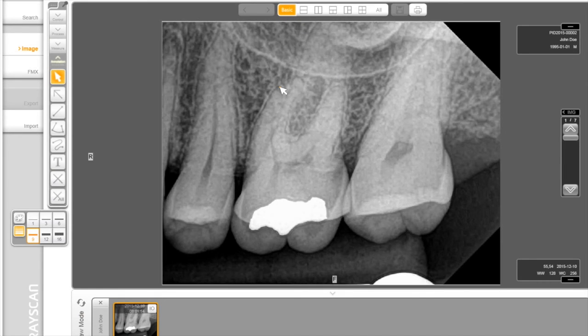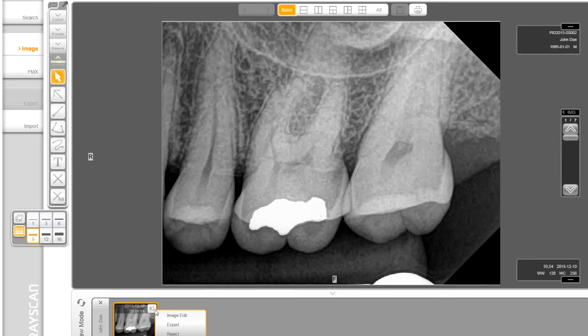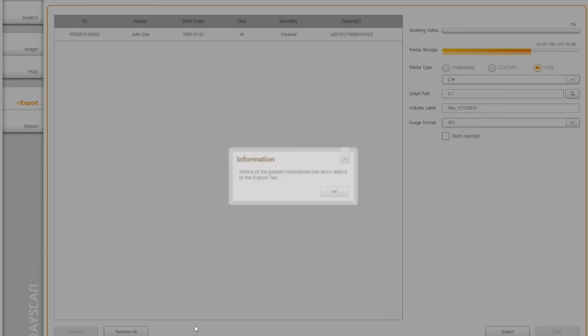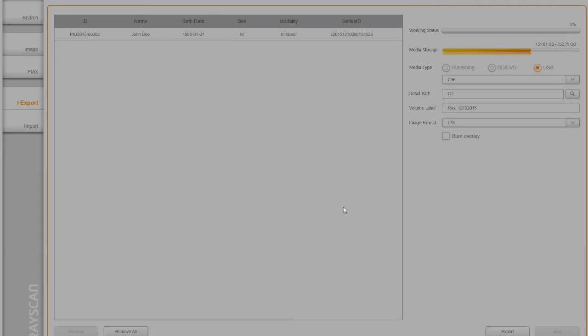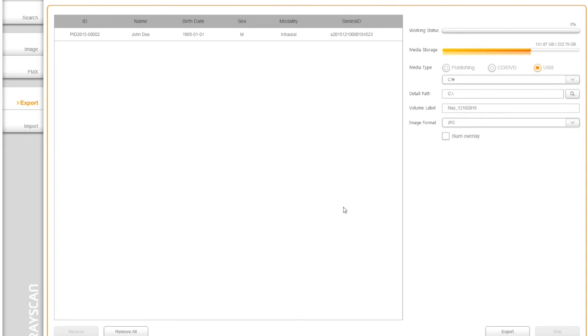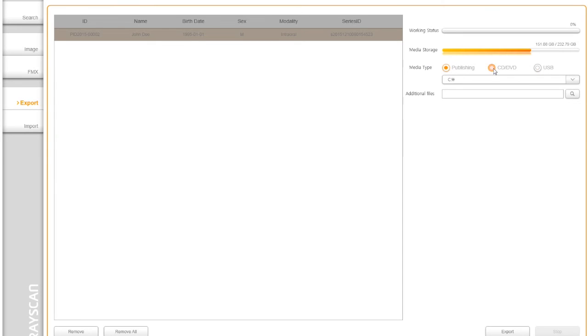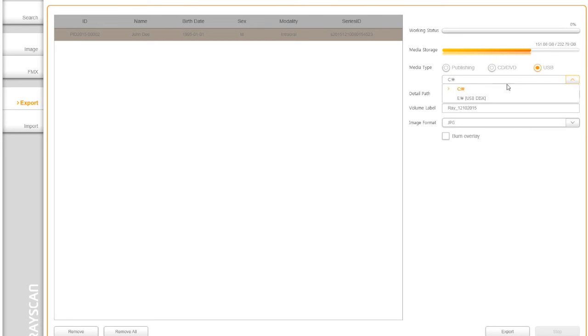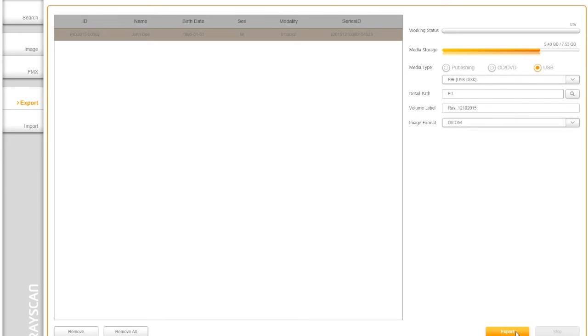In order to export an image outside of SmartDent, choose the image and click on the small IO icon in the layout view. Then click export. This utility provides the media type, such as publishing, CD, and USB as your preference. This interface allows users to export files to any location on the computer with JPEG, DICOM, or RAW format. Then simply click export button to finish.